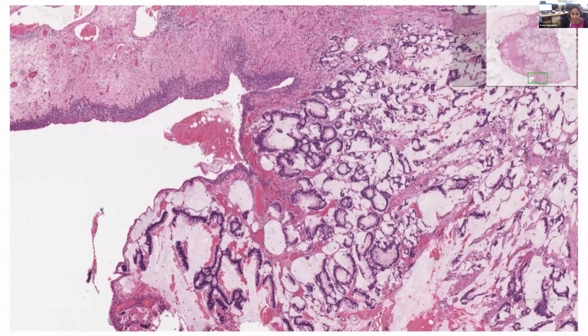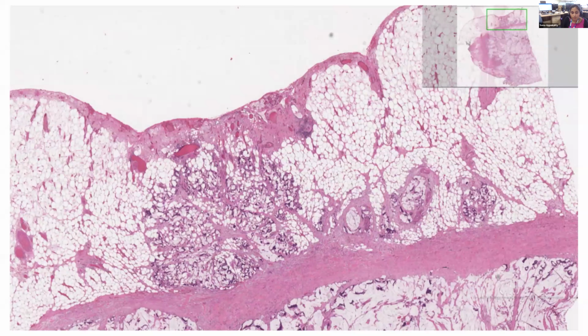And then we can see it is pushing towards the surface, but not breaching it, probably. And the epithelium appears non-dysplastic towards the serosal surface. Oh, there was no urachal remnant. There was no cyst formation also, forgot to say that. There's no breach of the serosal area.